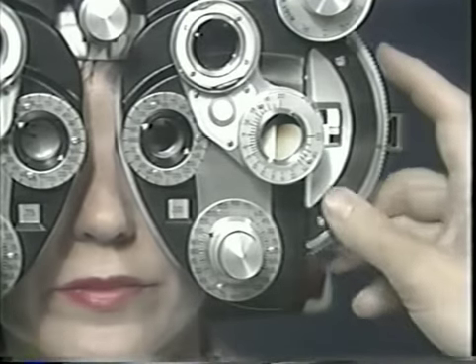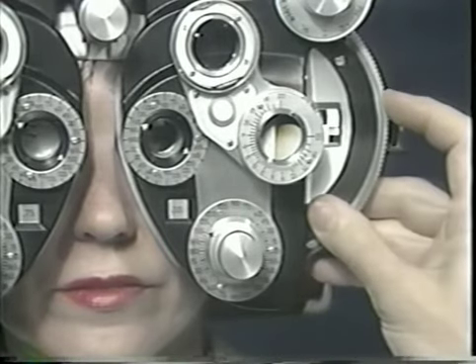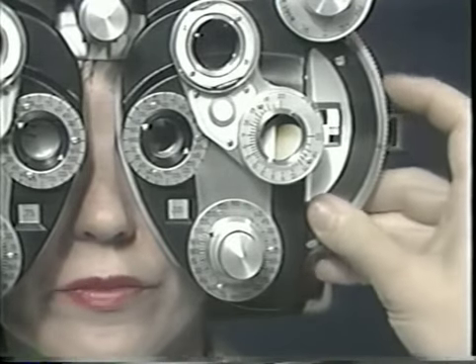APECTF. Okay, good. Now watch closely. I'm going to change it. Does this make it better or worse? Ready? There. Worse. Okay, let's go the other direction.